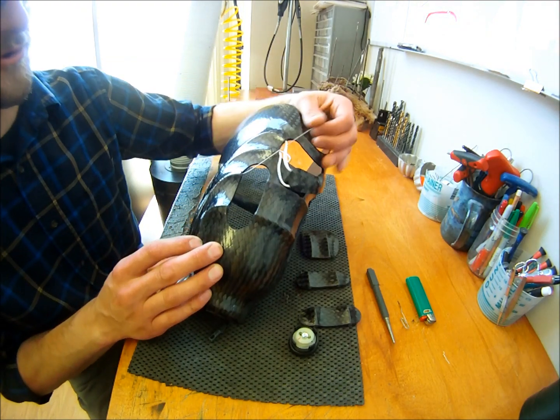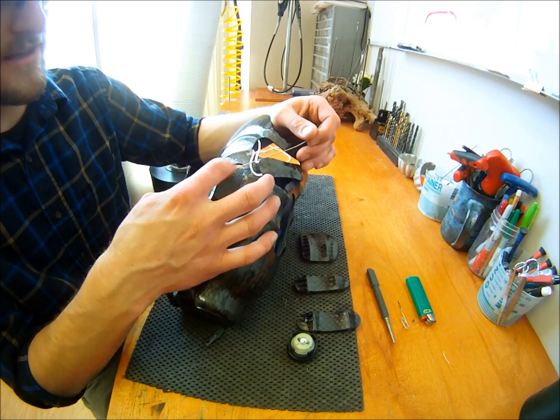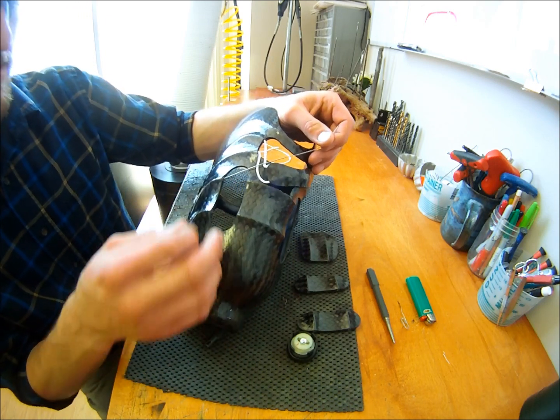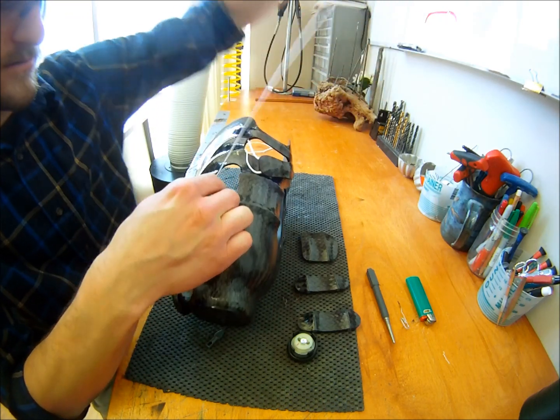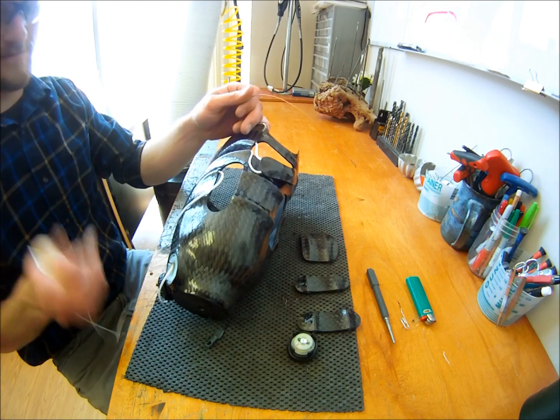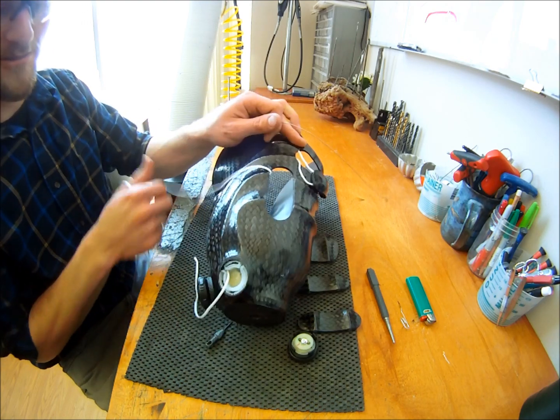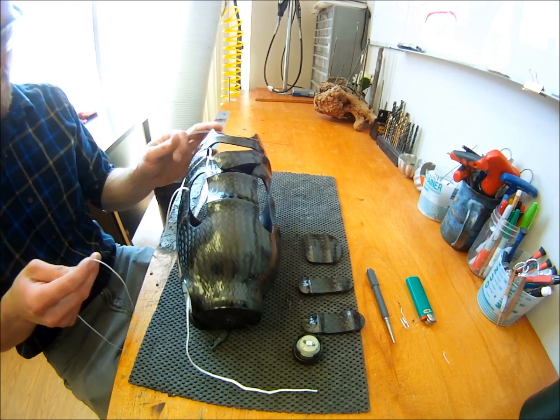And when you pull through, it's nice to put something, your fingertip or something like that, on the edge of the Teflon tubing so that you don't pull the tubing out of the socket. And it should slide through easily. You want to leave a little bit at the end here. Careful not to pull it all through.